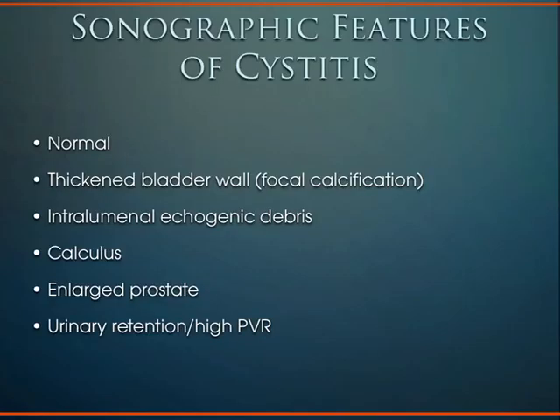You can also make a diagnosis of a bladder infection, or confirm the diagnosis. Again, usually it's a very clinical diagnosis, but sometimes the patient can't talk to you, or they're too young, or they're intubated, and you're wondering why they have a fever. As you're doing your fever survey with ultrasound, you can come down to the bladder and you'll see a thickened bladder wall. Sometimes you'll see some echogenic debris within the lumen of the bladder, or even a bladder stone.